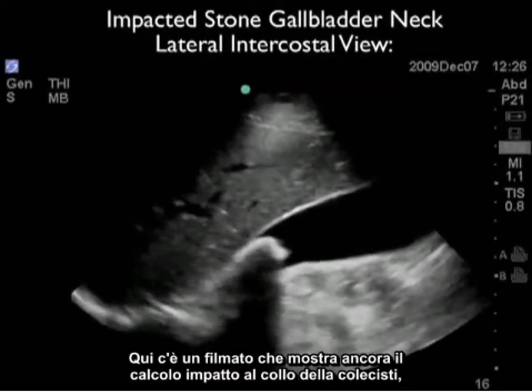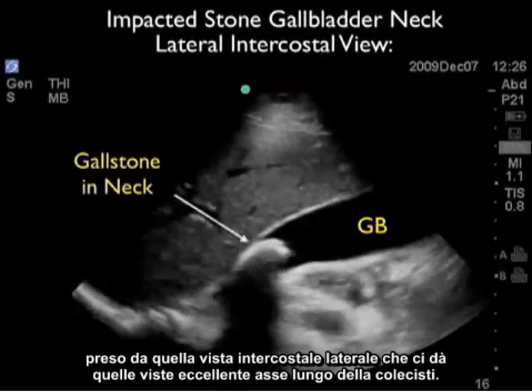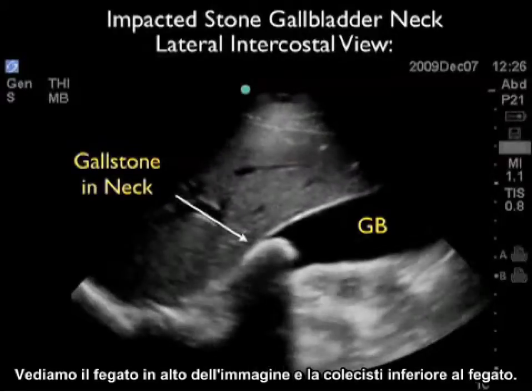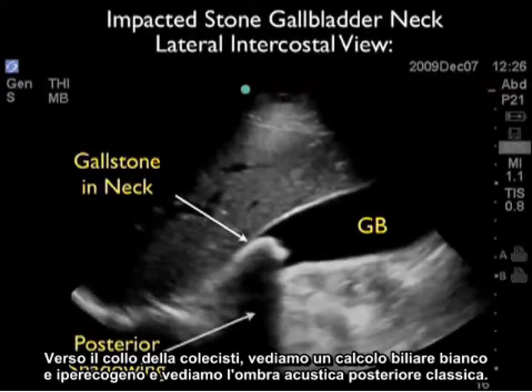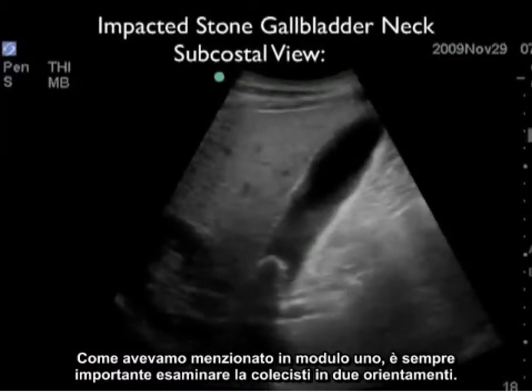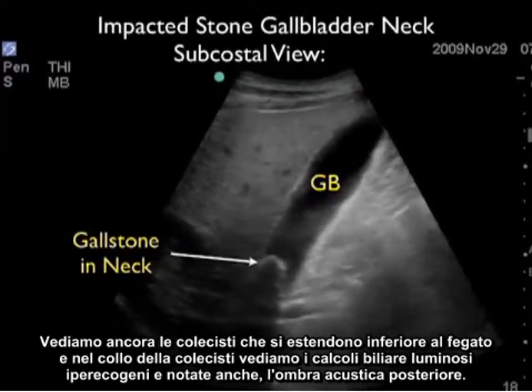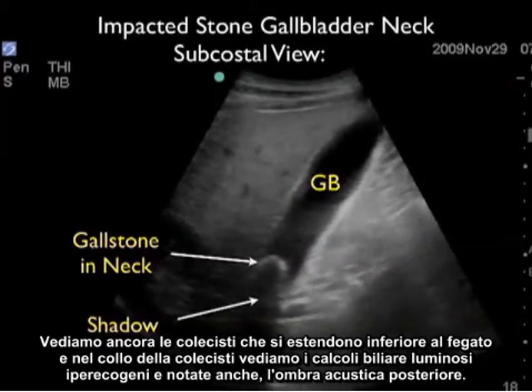Here's a video clip showing an impacted stone at the gallbladder neck, taken from the lateral intercostal view giving great long axis views. We see the liver at the top and the gallbladder inferior to it, with a white hyperechoic gallstone at the neck and classic posterior acoustic shadowing. We then move the patient into the left lateral decubitus position scanning from the subcostal plane, again seeing the gallbladder inferior to the liver with the hyperechoic gallstone at the neck and posterior acoustic shadow.